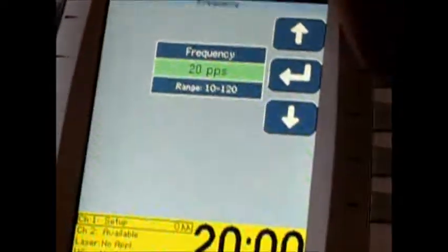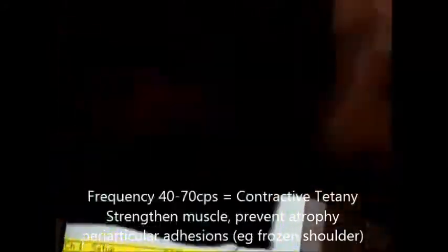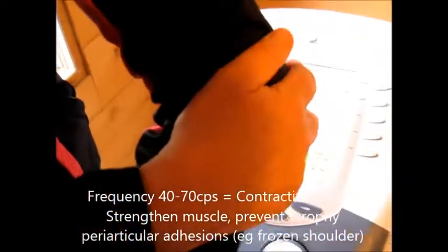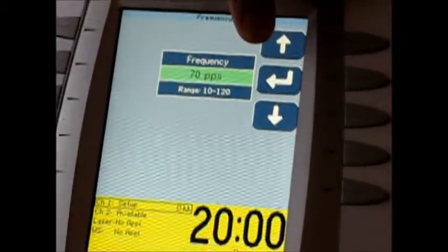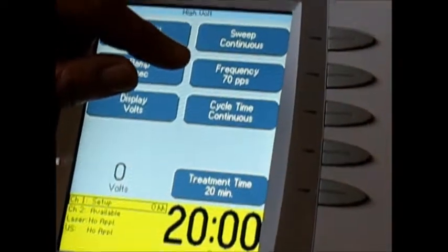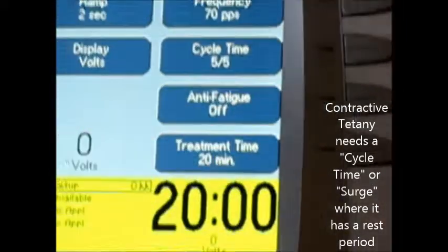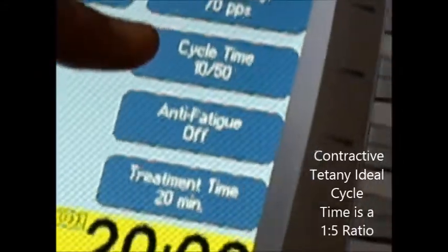The third setting we use in our practices is contractive tetany — to strengthen the muscles, to prevent atrophy, and to break up periarticular adhesions in an elbow or a shoulder, like frozen shoulder or chronic hip capsulitis. Anywhere between 40 and 70 cycles per second is called contractive tetany. With contractive tetany, however, you're going to need to set a cycle time. We like to have contractive tetany with a good rest between — it's like working out. You don't work out until you're very fatigued; you work out, take a rest, and come back. So contractive tetany will be set to a 10 to 50 ratio, or a one-to-five ratio.